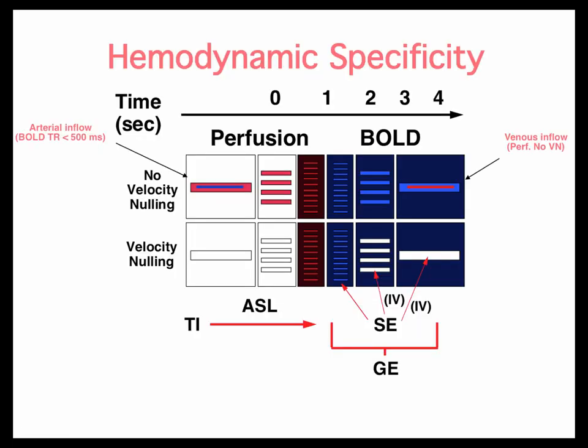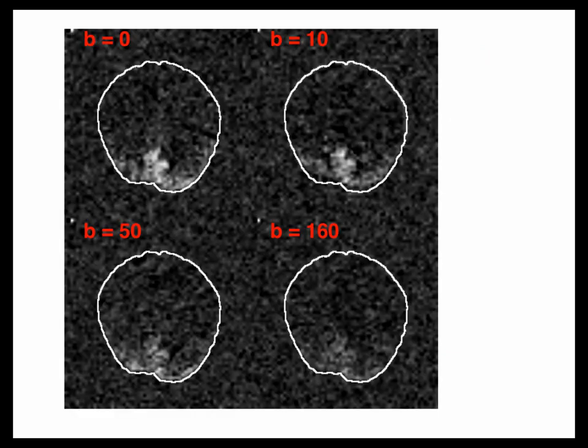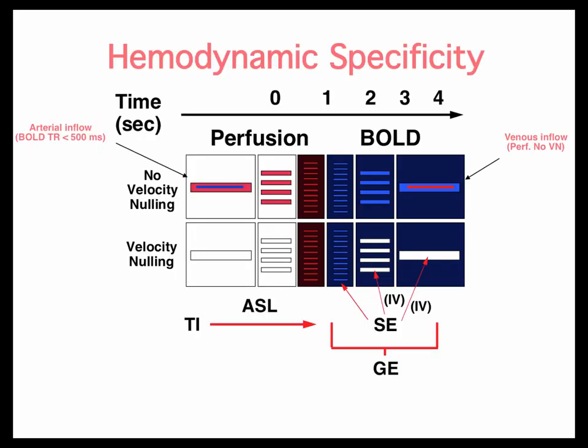Okay. So if you really want to get at it, the one experiment that people have tried, including myself, is to apply diffusion weighting and apply spin echo at 3 Tesla. And if you do that, you get absolutely no bold contrast whatsoever. You've gotten rid of everything, it seems. And so, unfortunately, those capillary effects that the spin echo still might be sensitive to are just not enough to really see much, at least at 3 Tesla.